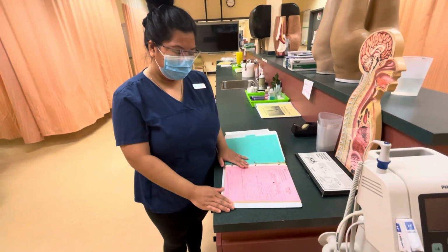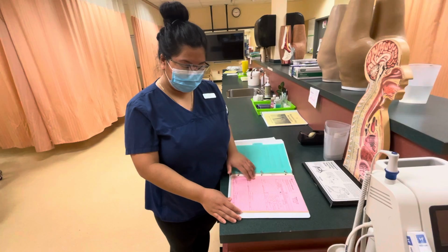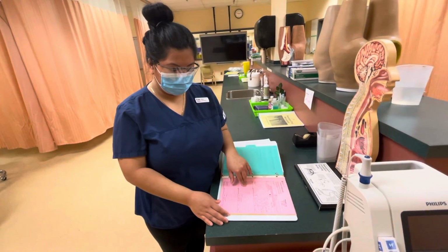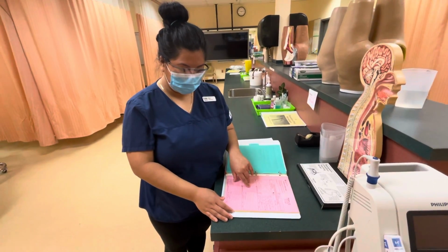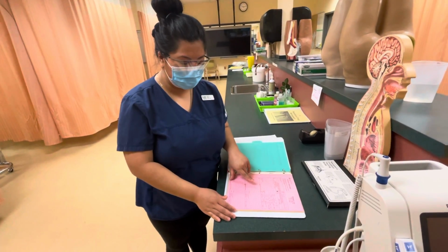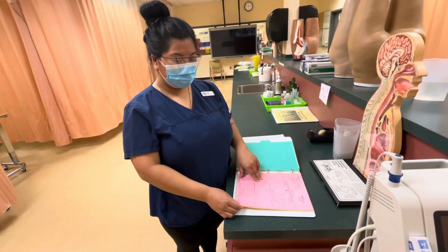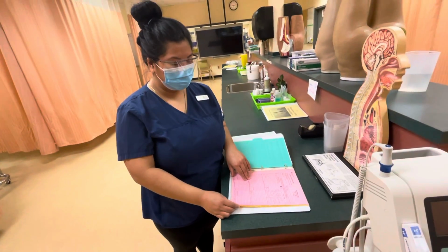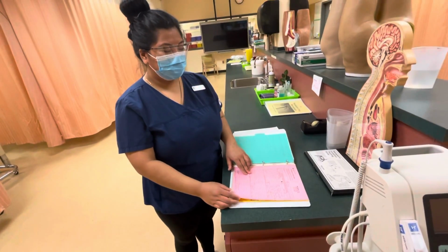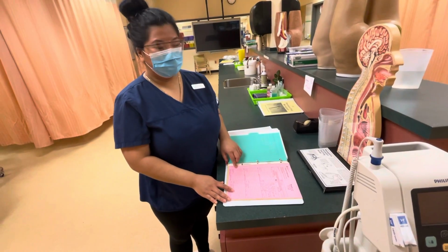We are doing a dressing change on our patient's left thigh laceration, and we have to change it twice a day, and as needed. We're going to cleanse with a normal saline solution and then pack the wound with a normal saline soaked 4x4 gauze. We're going to cover it with another 4x4 gauze and an abdominal pad, and we're going to secure that with a Kling wrap.